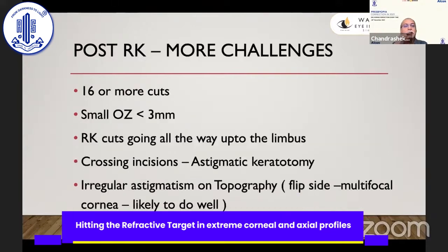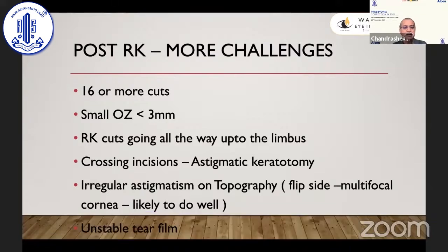Best practice is to go to ASCRS, which uses the Aramberry double K method and Barrett online calculators, and choose the average. Now, it is very important to examine the patient on slit lamp and understand the risk factors where you can go very badly wrong off the target.